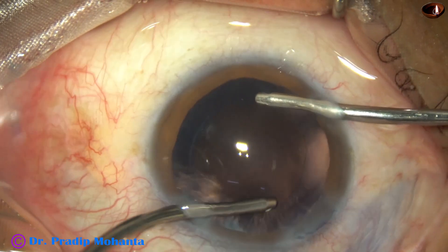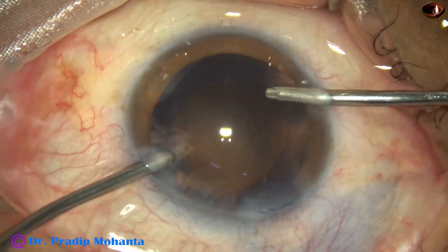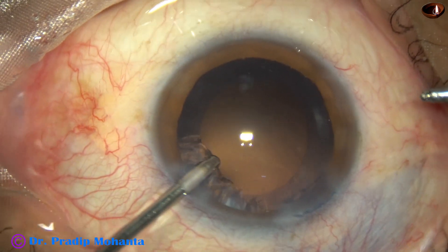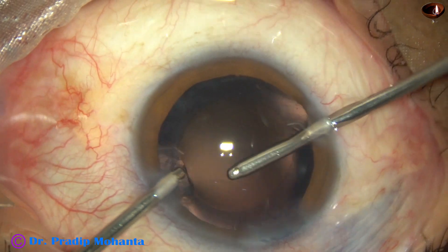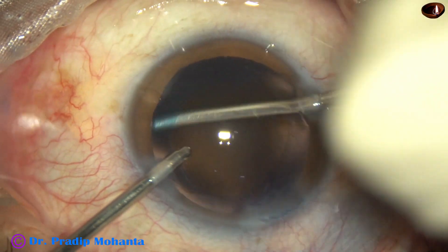Almost 270 degrees of cortex has come out. Now, this is one quadrant of cortex from 12 o'clock to 3 o'clock, and it is easily removed.